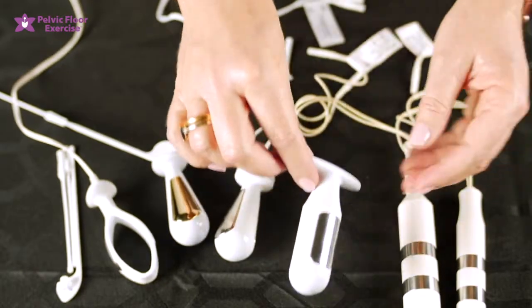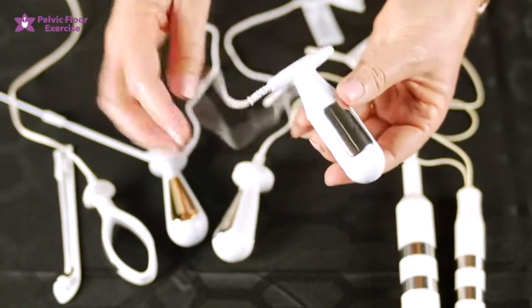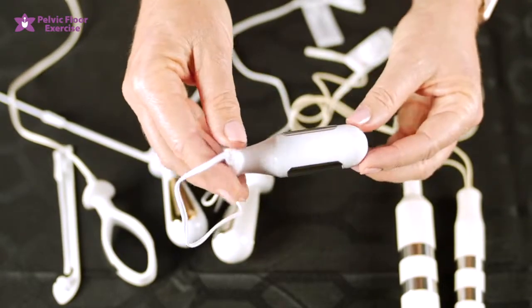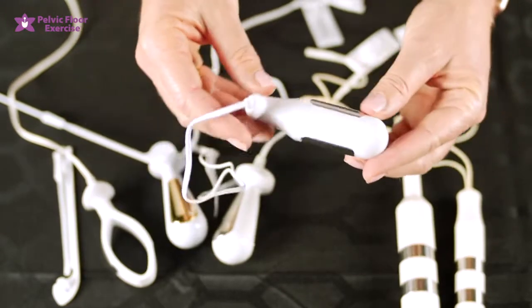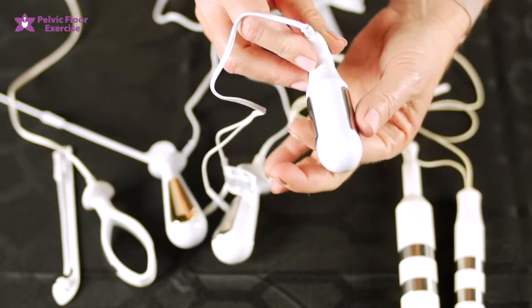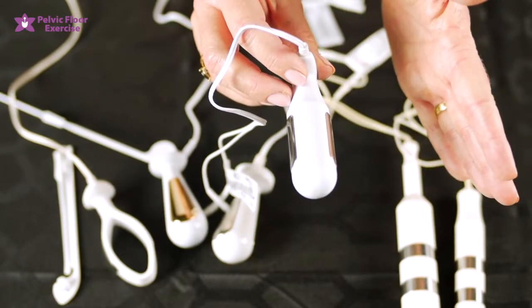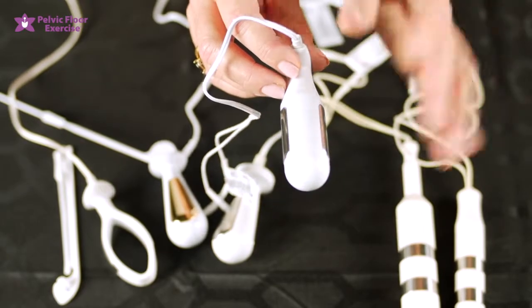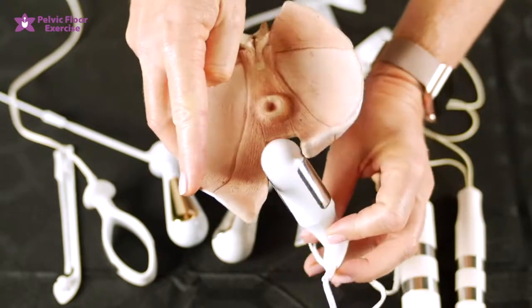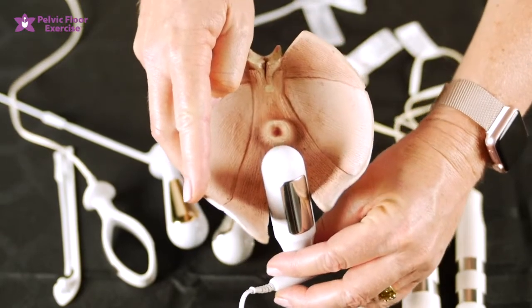Moving on to the PR18 — this is a good all-round electrode. It has a flange on the end which gives you something secure to hold as you insert and withdraw it. The large plates on either side are very good for ensuring contact. It can also help you orient so that one plate is facing your left hip and one is facing your right, which means it will have good contact with the pelvic floor muscles. If you feel the flange is turned the other way, you know you're not going to be in contact with the muscles.